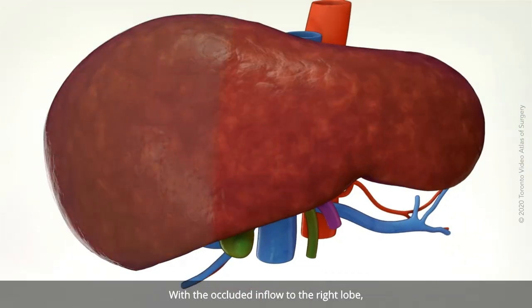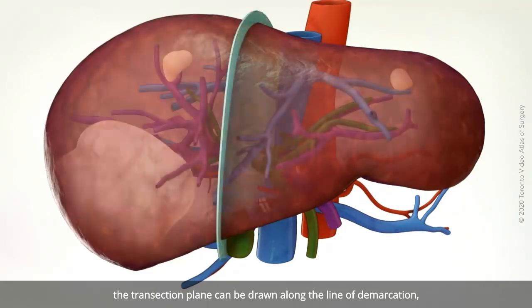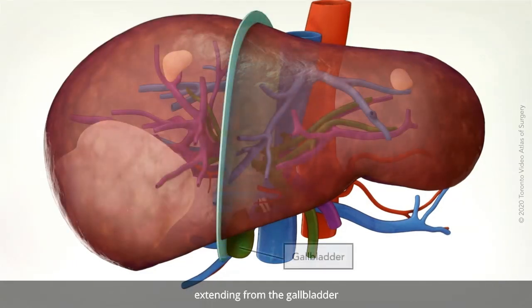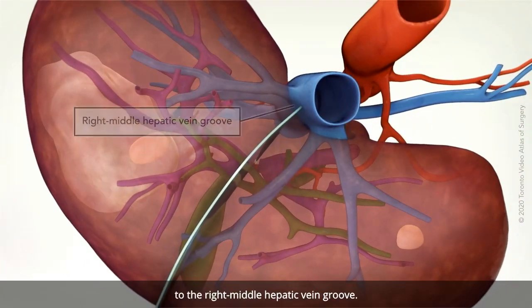With the occluded inflow to the right lobe, the transection plane can be drawn along the line of demarcation, extending from the gallbladder to the right middle hepatic vein groove.